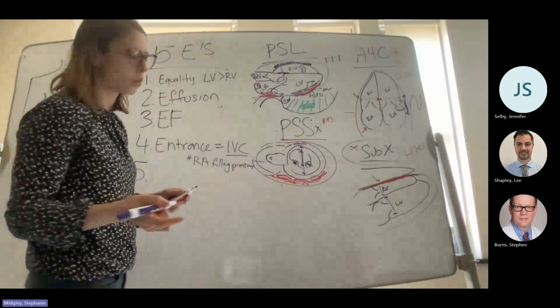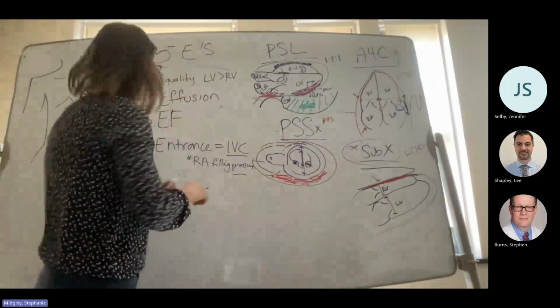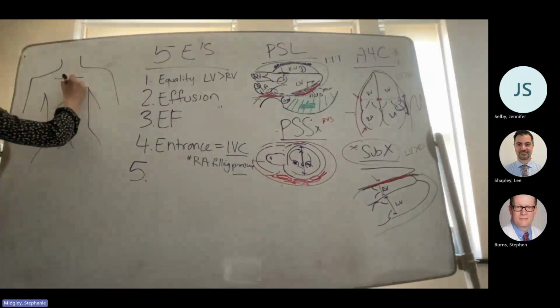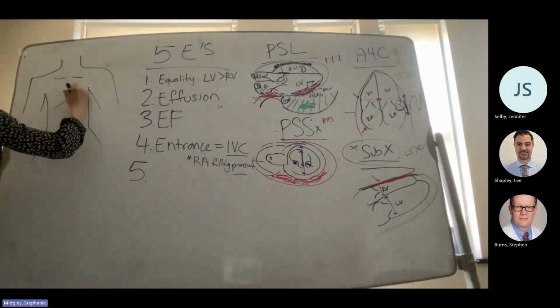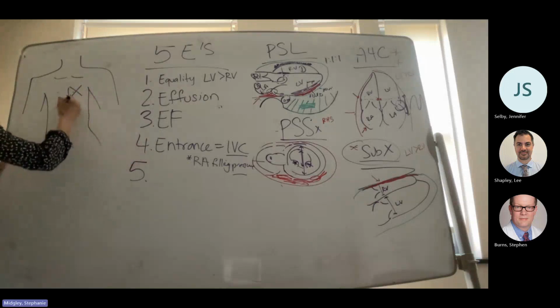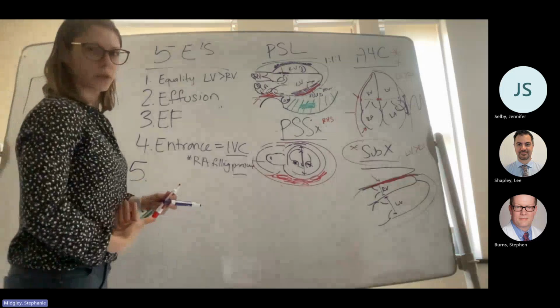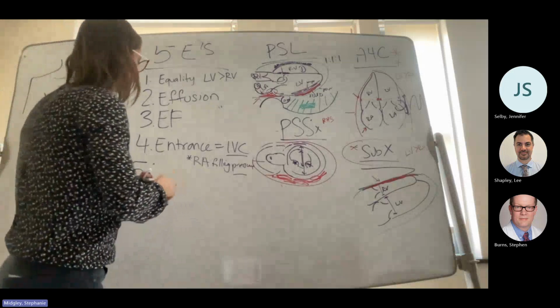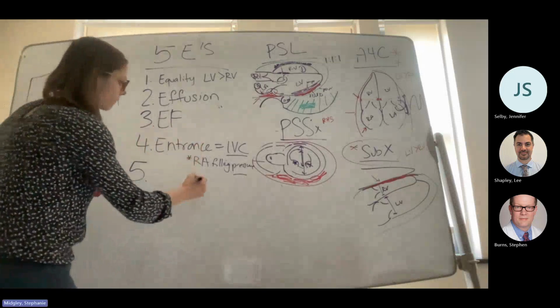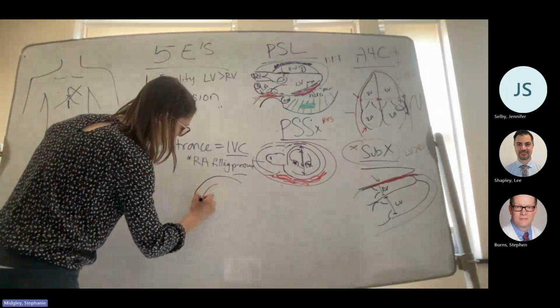It's also really important to know where to look when you're looking for IVC. So the way you get it, this is your parasternal long. You're going to rotate to get your parasternal short. To get your IVC, there's two places. You can either come in the center of their belly and make sure that your probe is rocked upward, so the beam is kind of aimed up towards the chest. And what you want to find is your liver and then the hepatic vein.